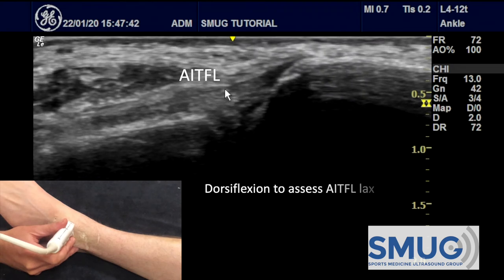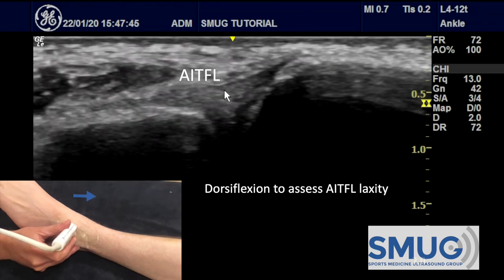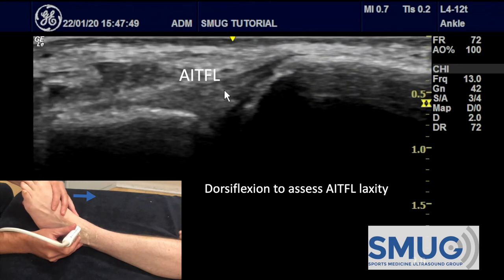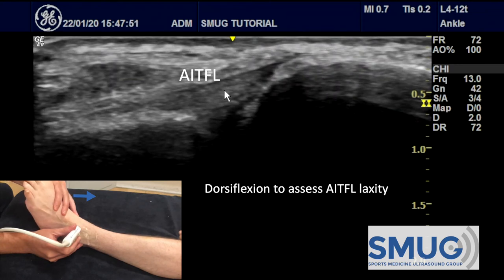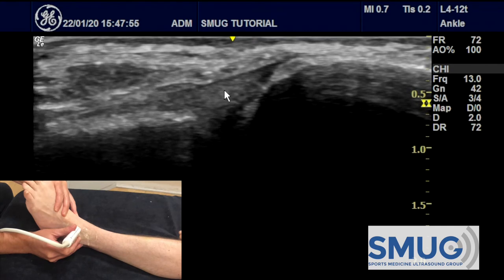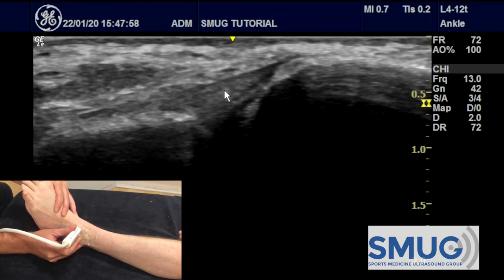To assess the laxity of this ligament, we use dorsiflexion. If I gently and passively move the foot into dorsiflexion, despite the movement, you can see that the tibia and the fibula do not open up at all. So that ligament is doing its job.